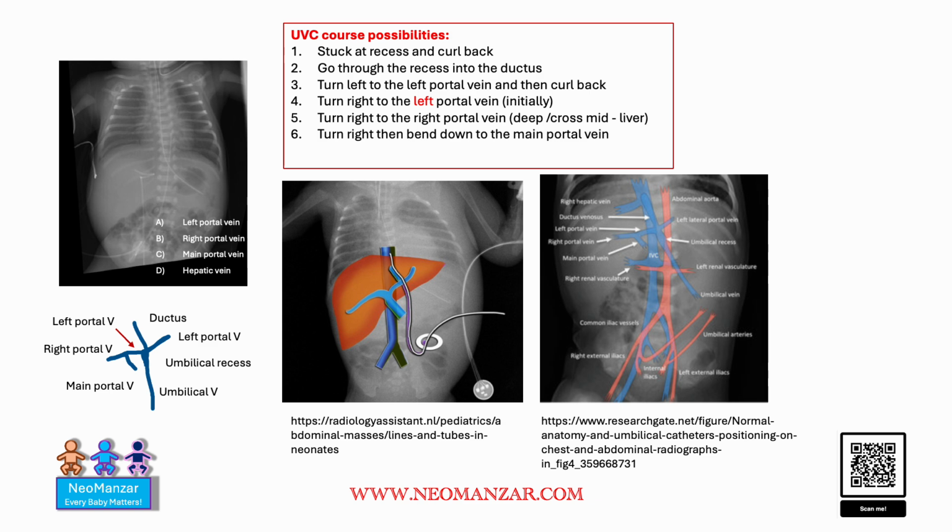So when you have time, just go through these references, and these references really explain it very well. But we have summarized here for better explanation. So basically, there are few possibilities where the UVC can go. So let's first try to solve this thing out.